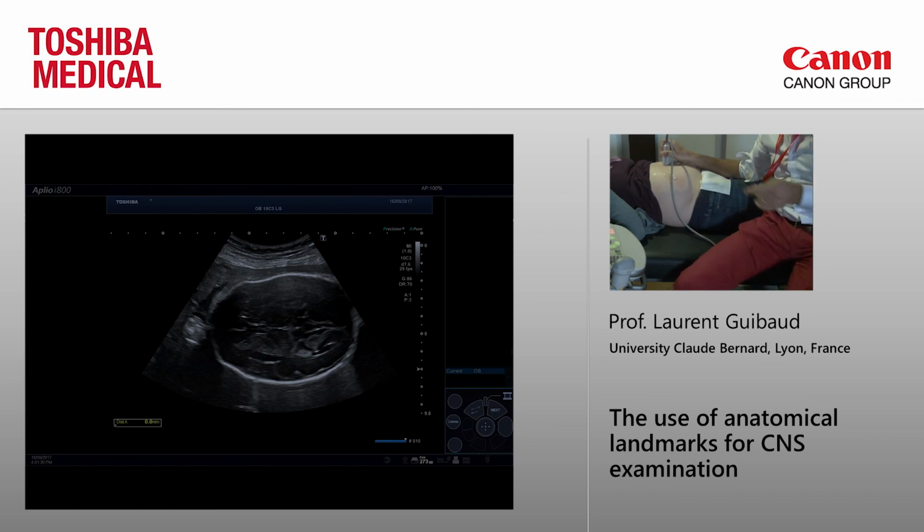When we do transfontanellar ultrasound in neonates, we know that we have to measure the pericerebral space at the level of the anterior interhemispheric fissure. And we have norms for the interhemispheric fissure space. When it's more than 6 or 7 millimeters, you may be dealing with benign macrocephaly. But in the prenatal period, we have no norms. So it's a very subjective assessment, normal or not normal.